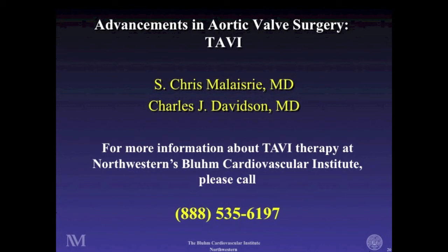So for us, we look at it on a case-by-case basis. The commercial valve itself does not specifically exclude patients with bicuspid aortic valve, so long as the patients qualify in terms of high risk or inoperability. So I think an individualized approach is going to be important for patients with bicuspid valves that are stenotic, that are tight.